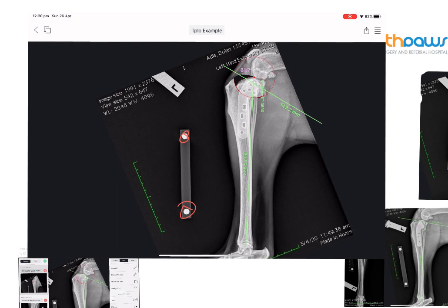There are a couple of critical things when planning our osteotomy location and saw blade size. First, we want our center of rotation right over the intercondylar eminences — within a couple of millimeters. Second, we want to look at the tibial crest shape: after the cut it should be wider at the base than at the tip, forming a nice trapezoid shape. If the tibial crest is very narrow and skinny, we risk a fracture through the tibial crest. Those two things are really critical in this plan.